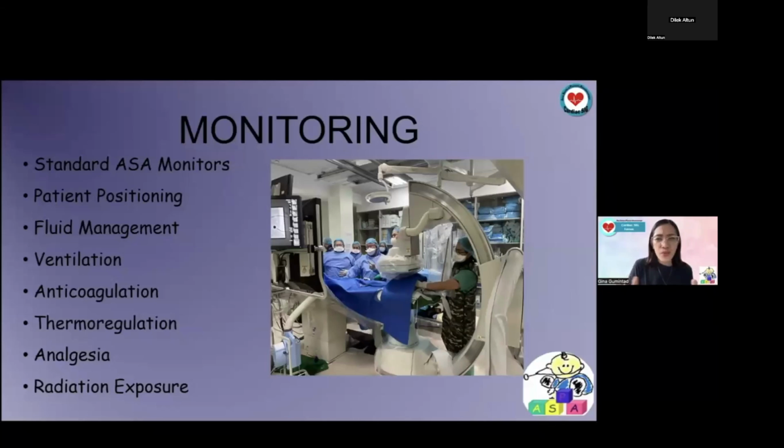So actually, we have limited space in the Cath Lab. It's a sizable suite footprint. So access to the patient sometimes remains limited by equipment and other specialists centered around a very small patient, as we can see in this picture. The patient is very small, covered by the drape, and we have very limited space also because of the C-arm for the imaging of the patient.